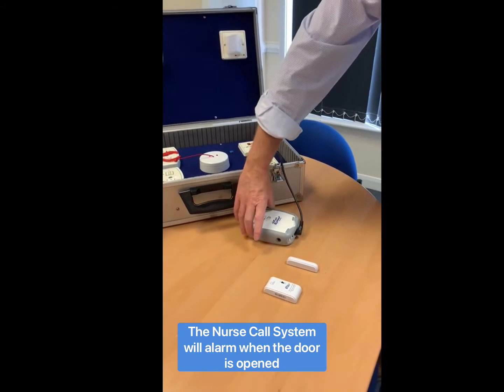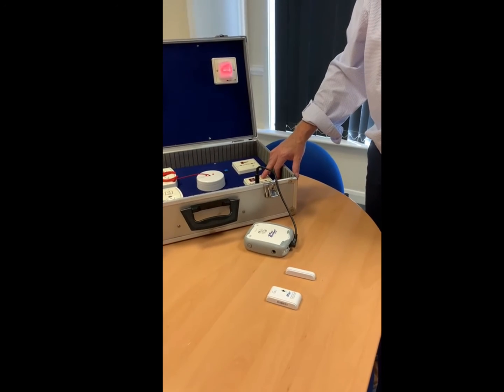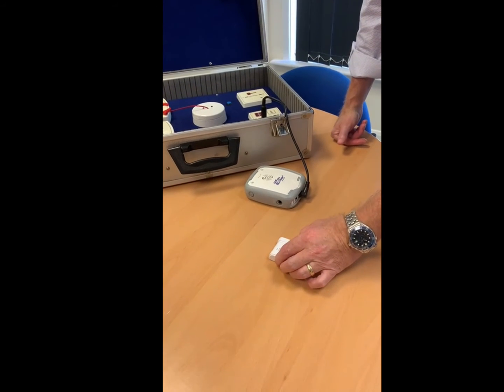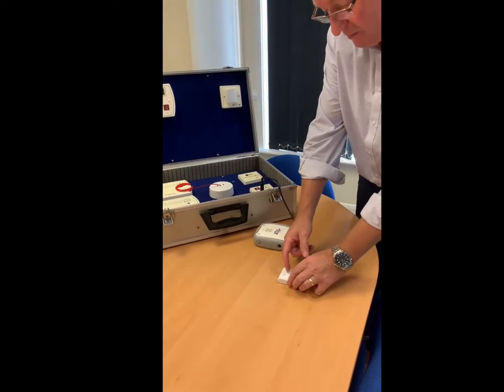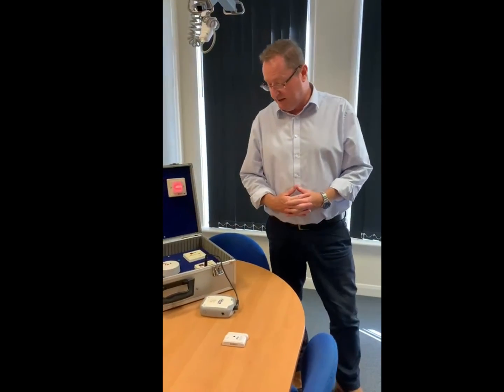We cancel it by cancelling on the full saver unit, and we also have to cancel it on the call point. And as soon as the door is reattached, it will reconnect and then carry on. Obviously when you don't want to use it anymore, we turn it off, and turn it back on when we need to use it.